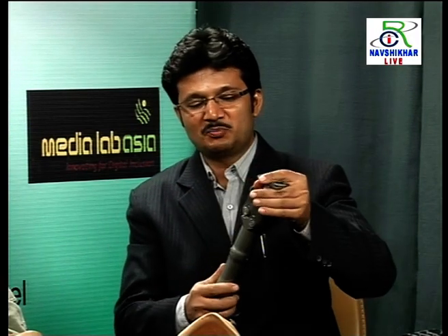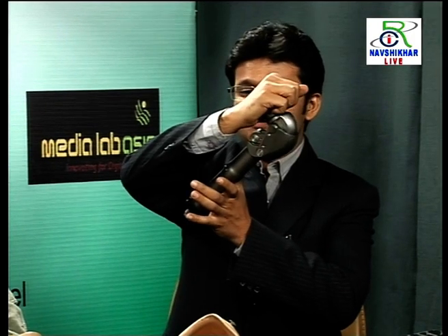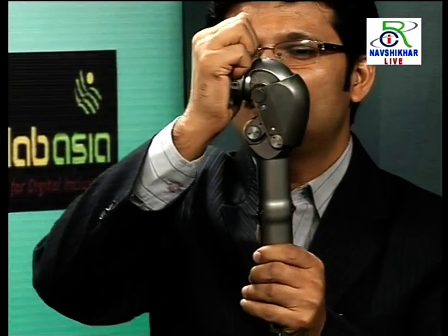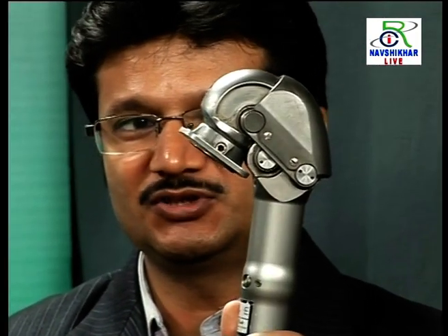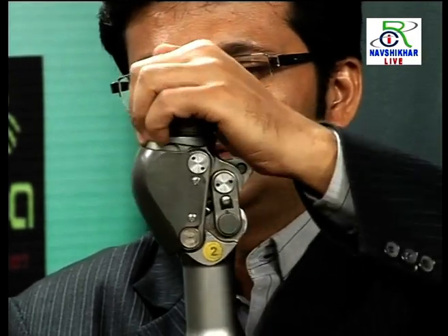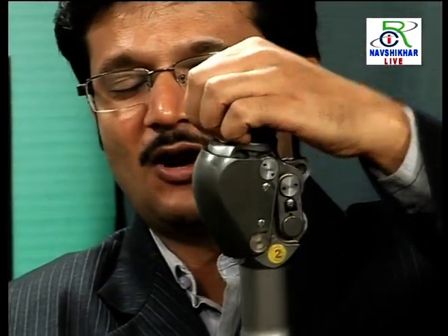It decelerates and prevents the knee from noisy impact sound, and during heel strike its speed increases because in the piston the energy is stored and then released while advancing the limb. So the patient does not have to make so much effort with such a limb, and when the patient sits down, it automatically gets locked in that position. When the patient stands, it provides total stability with such a 4-bar linkage knee. We cannot easily push out the limb. But when the patient advances his sound limb, it automatically gets rotated.